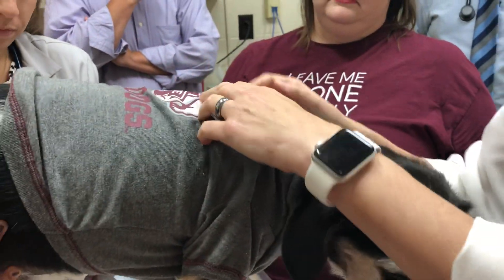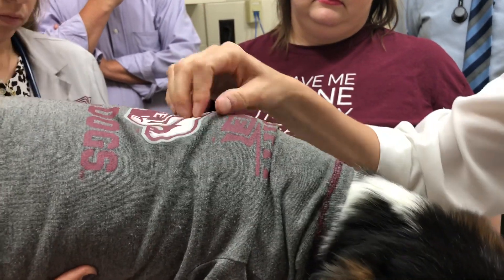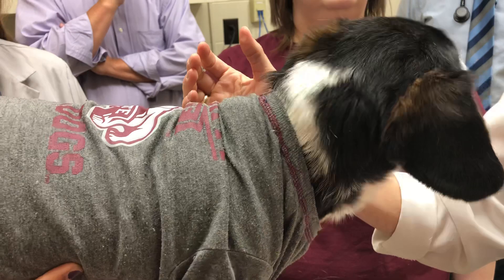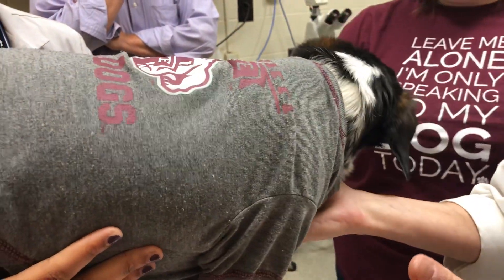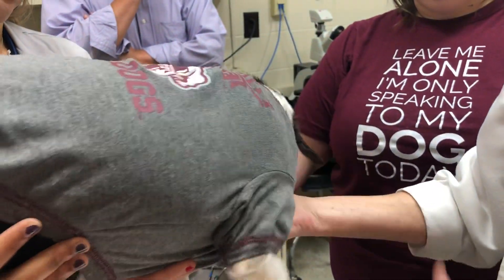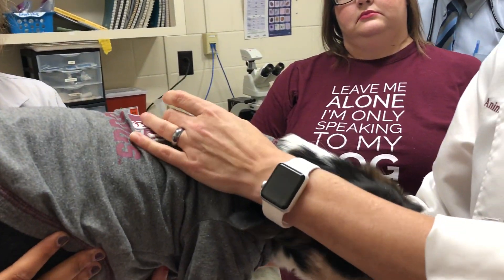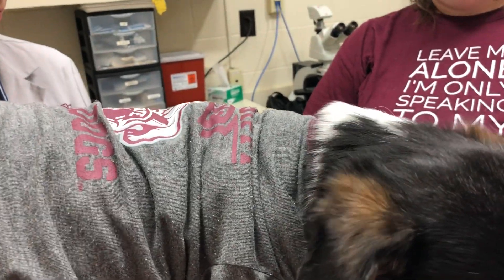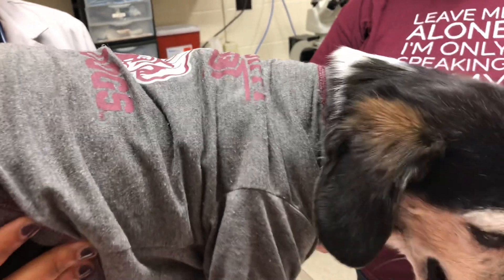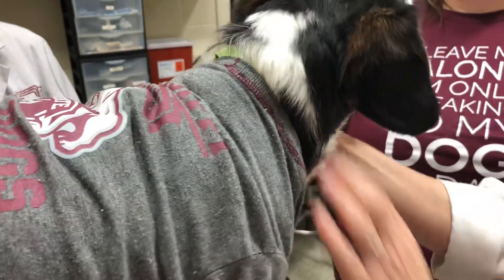You can hold the reader device just above it and it'll take readings for up to ten days, every 15 minutes. It has to sit for 12 hours before it starts taking any readings. The actual sensor only holds glucose readings for eight hours, so if you're gone for ten hours it will lose the first two hours of readings, but you'll still get the next eight hours, and the reader will keep those readings forever. That's it — thanks Buddy!